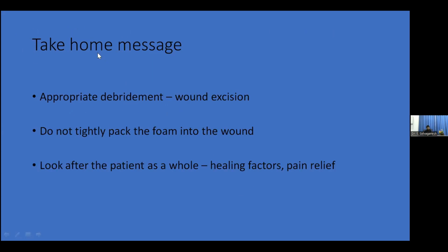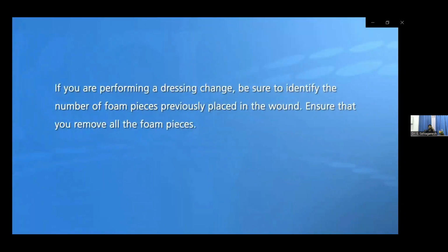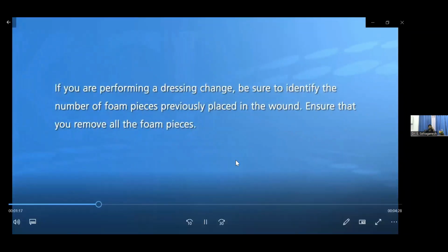So again, the take-home message is appropriate debridement, wound excision, and so that is very important. Without doing an appropriate wound cleanup, don't apply the dressing. So don't tightly pack it. You will understand with the video. So look after the other factors. And I will play a video, and then you will understand that you remove all the foam pieces.